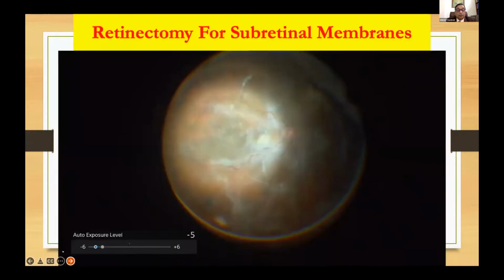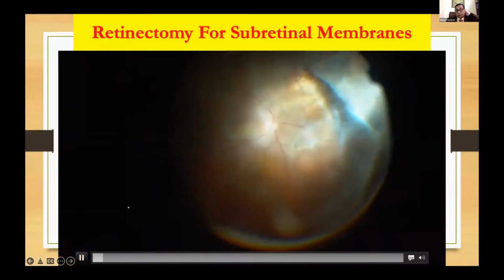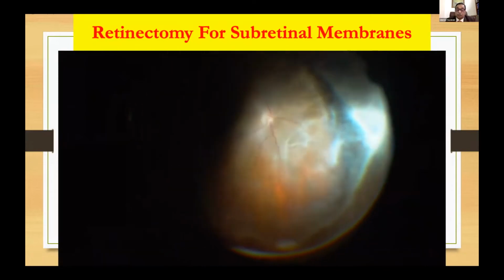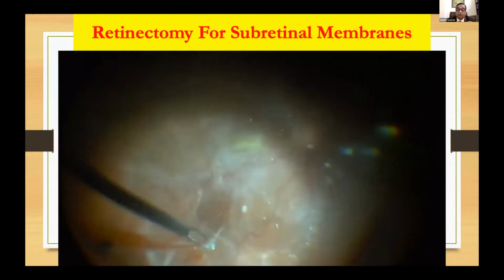Now, what you see over here is a patient in whom there's a vitreoschisis, and you can see there is a membrane which is covering the entire retinal surface.